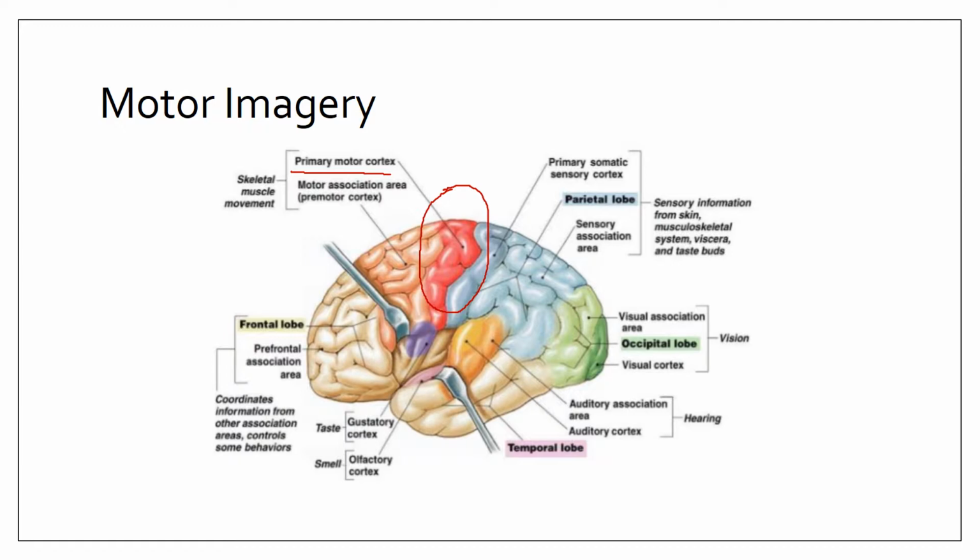It has been shown that motor imagery leads to the activation of the same brain area as actual movement, namely the primary motor cortex. Many investigations related to motor imagery use this information to only prepare the electrodes located within that region, which are the electrodes C3 and C4.